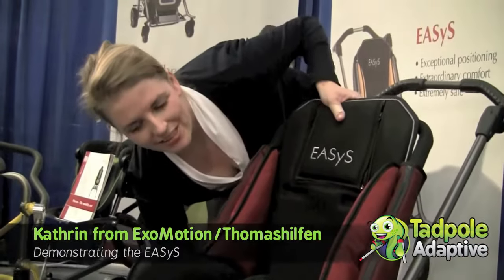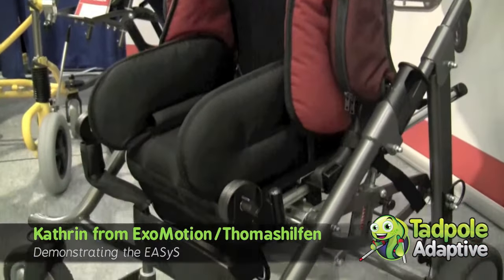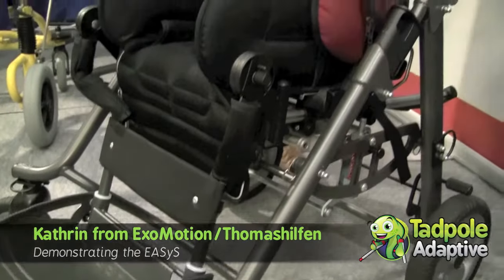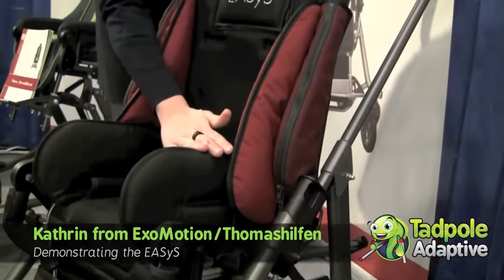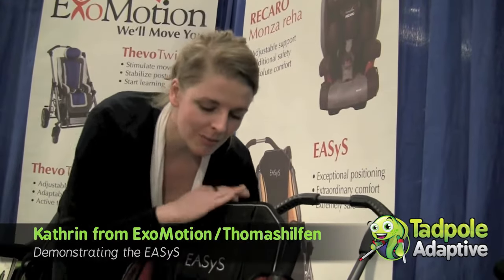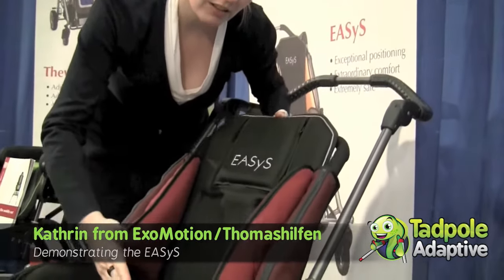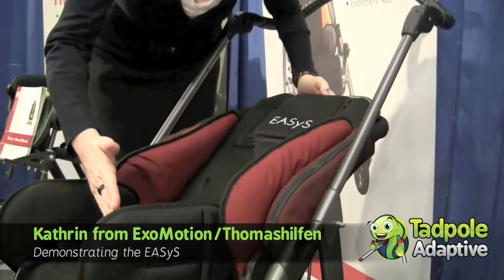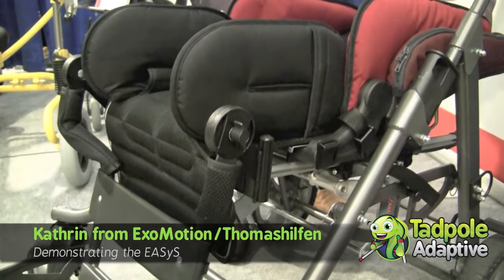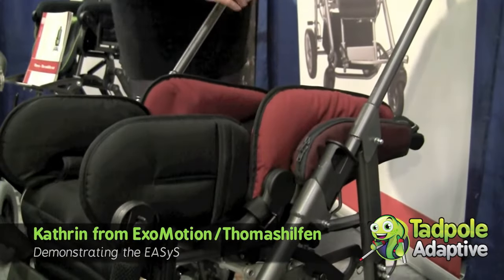You can do the tilt in space. And you can do the full recline. What is very important for the Eases is — it's called the balance safety system. So if you do the full recline, you can see that the point of gravity goes to the front. And with that, the whole stroller is still very stable if the child lies in it.